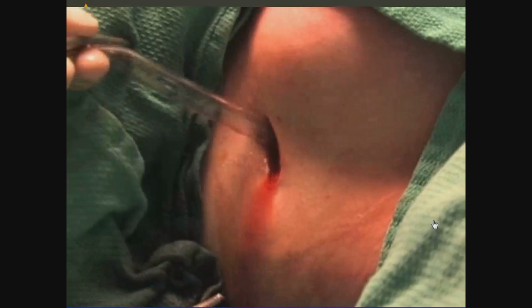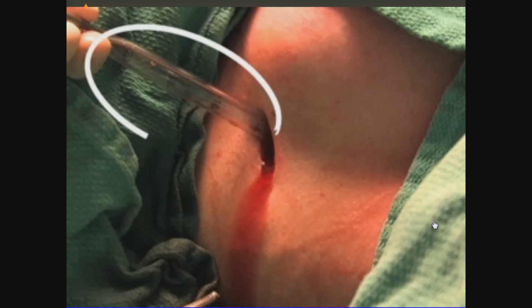Make note of the depth the tube has passed by keeping track of the numerical markings on the side of the tube.